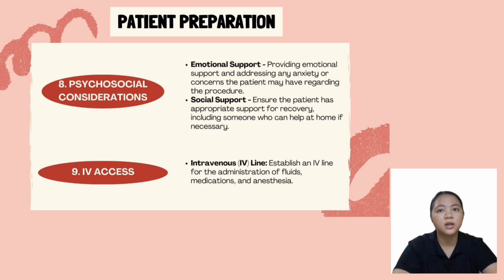So, alam naman natin na yung IV access can quickly and efficiently deliver medications, fluid, and other necessary treatment during the surgery. So, dito naman, pinapadaan yung mga anesthesia at yung mga, tulad nga ng mga nabanggit ko kanina, yung antibiotics na nag-help mag-prevent ng infections and blood pressure medications para naman ma-stabilize yung blood pressure natin.